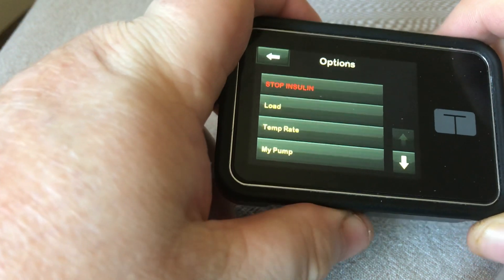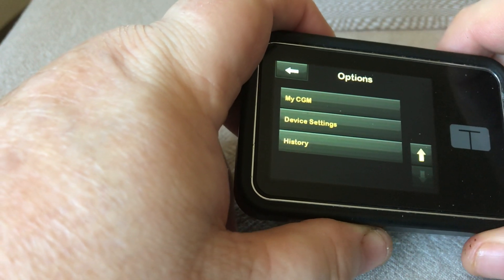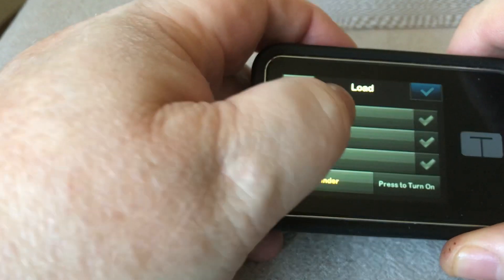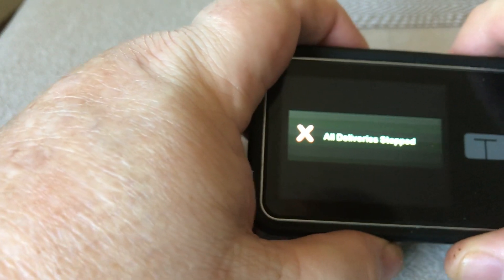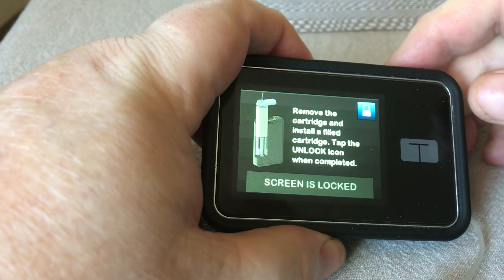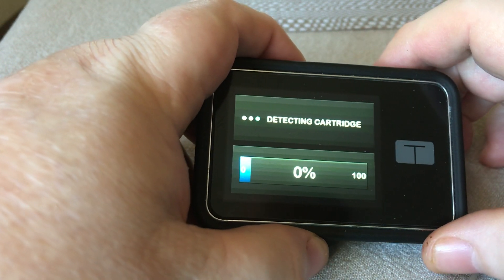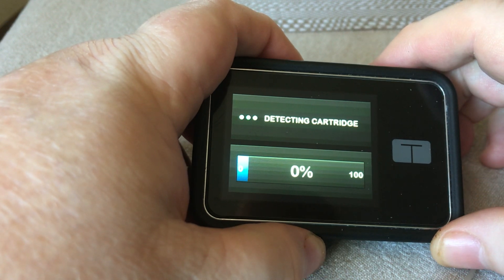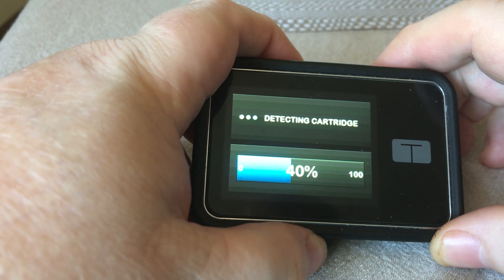On the G5 T-slim, you would have to page down and you would get the load option there. But once you're in load, it's exactly the same. So: load, change cartridge, tick — the old confirmation that we're all used to — preparing. I've removed the old one and the new one's installed because it's the same cartridge. Now this process can be done without even disconnecting, so I'm still connected to the pump during all this.